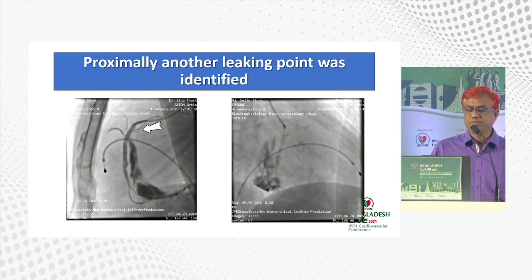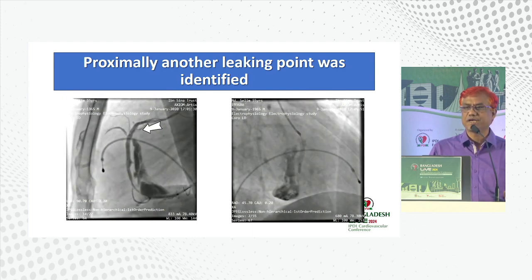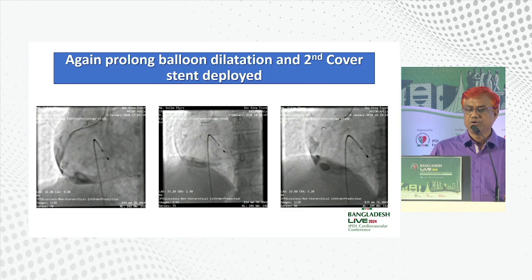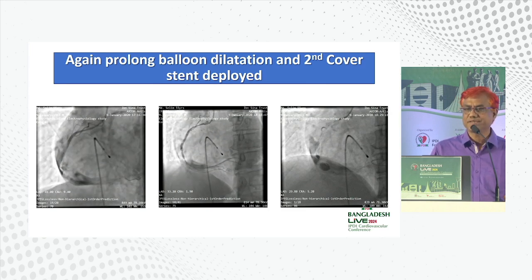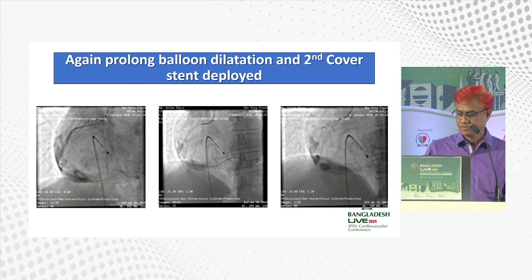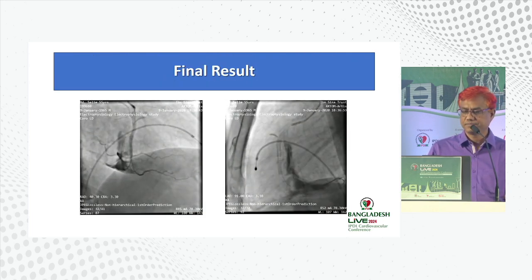After that, the first cover stent was deployed. Then proximally another leaking point was identified. Then we planned for prolonged balloon dilatation, and a second cover stent was deployed. This is the final result.